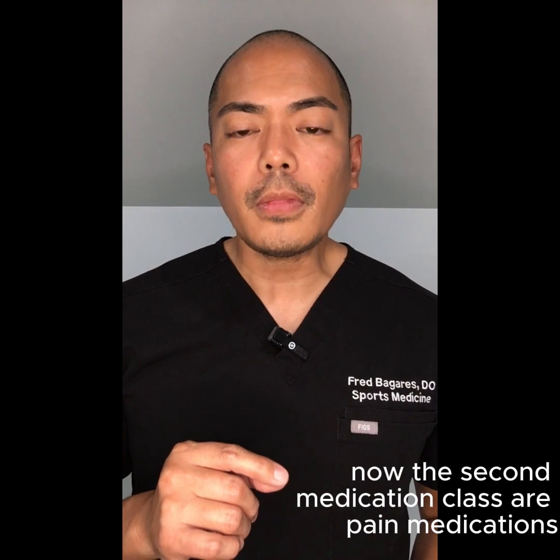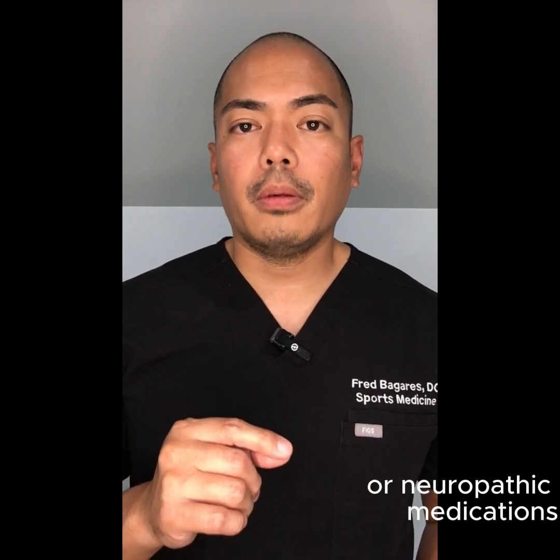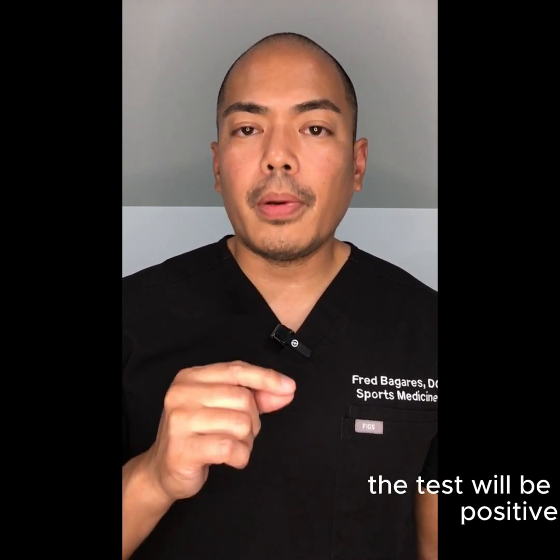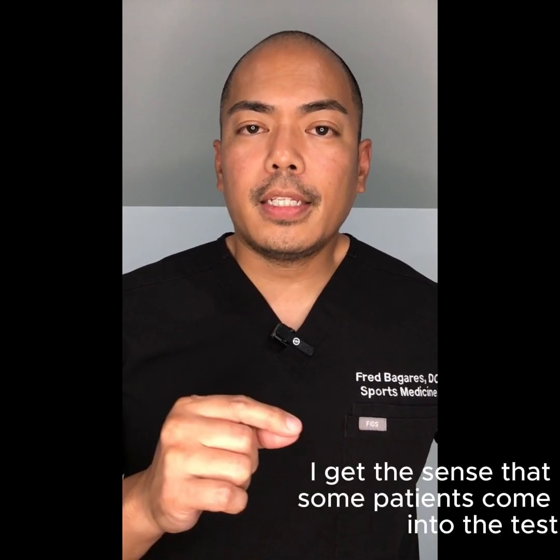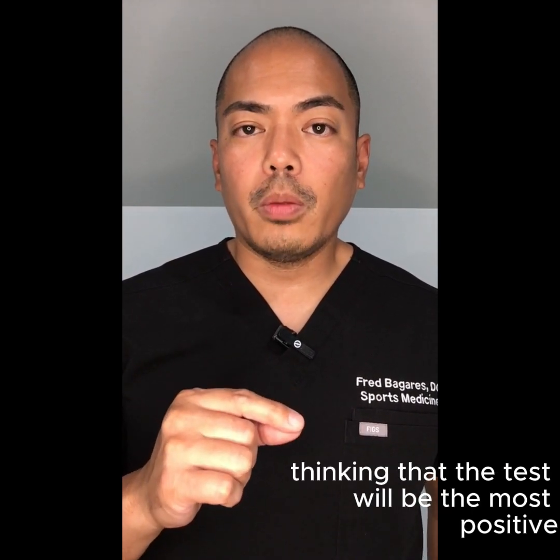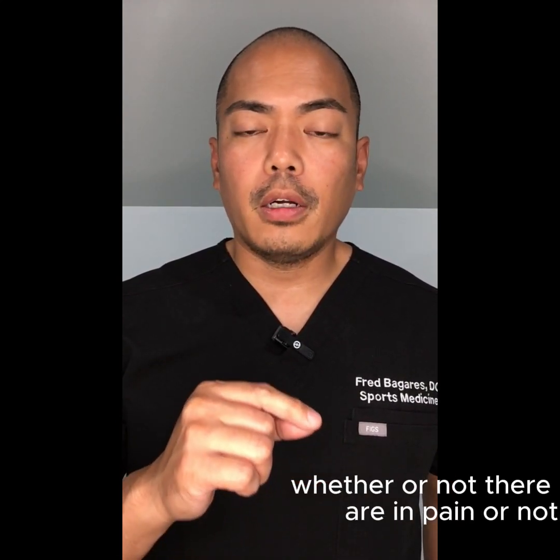Now, the second medication class are pain medications or neuropathic medications such as gabapentin or Lyrica. The test will be positive regardless of how the patients feel that day. I get the sense that some patients come into the test wanting to be the most symptomatic, thinking that the test will be the most positive if they are symptomatic during the time of testing. And that's just not true. On the whole, the test will be positive whether or not they are in pain.